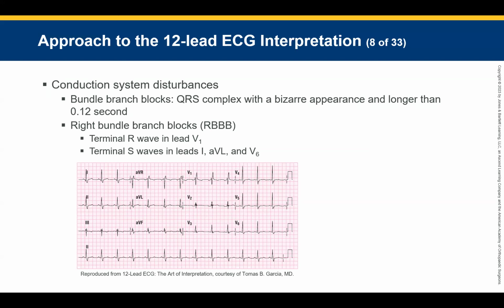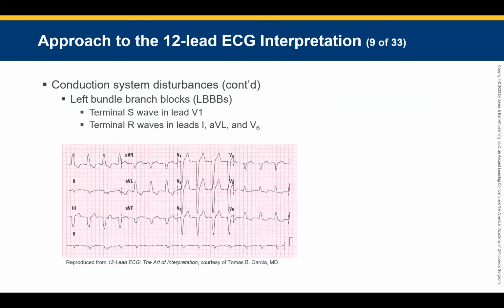Okay, so we get our width in V1, our QRS duration. That computer model will print that out for you, or you can count small boxes. I would always double check your computer model just to make sure you're set. Let's do this one. I can count that wide from here, okay? So go back to, oh, the underlying rhythm's junky. Let's look at that underlying rhythm. Looks pretty rough, okay? We're looking at all of our leads here to see, does anybody see P waves throughout any of our leads here? No, it's pretty rough, isn't it? Pretty rough.